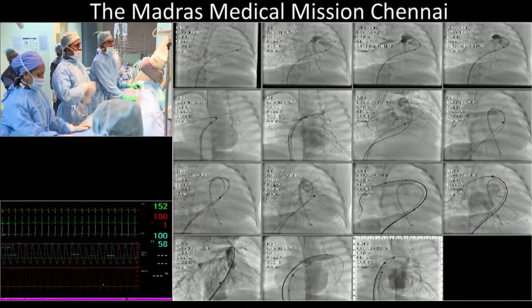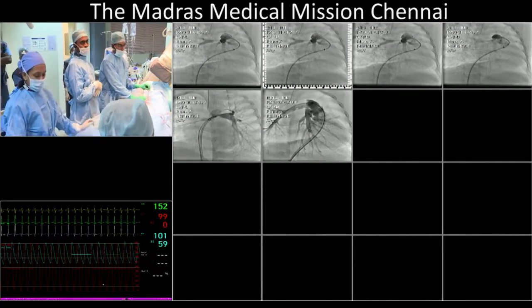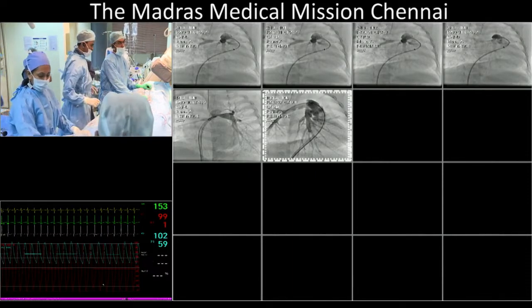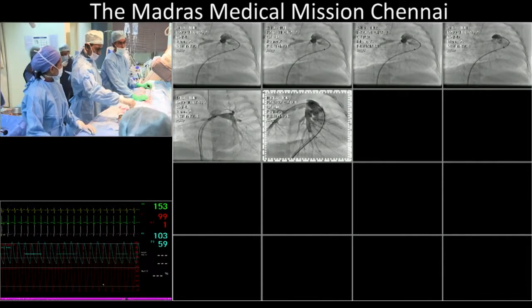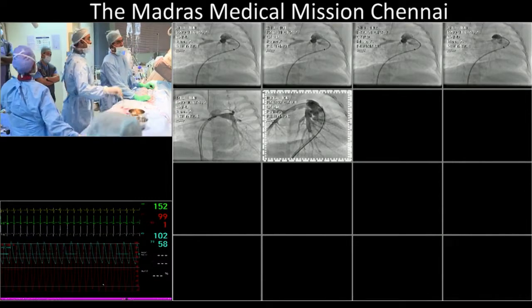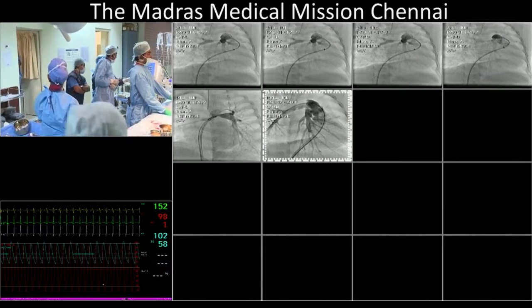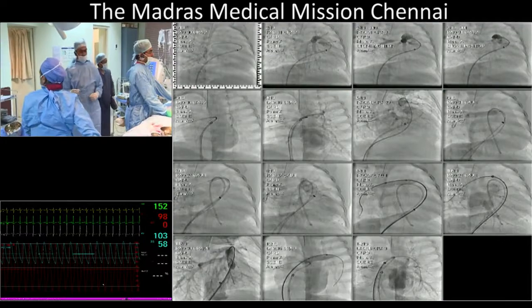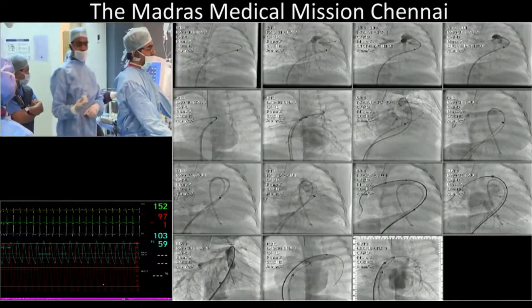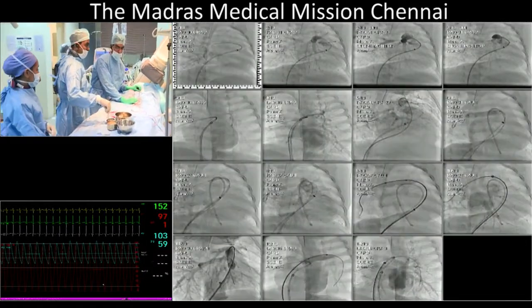Yeah, I just don't understand exactly why the right ventricular pressure is suprasystemic now. Presumably the ventilation side is not a problem. CO2 is not increased. No, actually the blood gases are fine, PO2 202. The child is on mechanical ventilation. CO2 is some 25. Yeah, all are normal. Okay, the anesthetist is controlling everything.